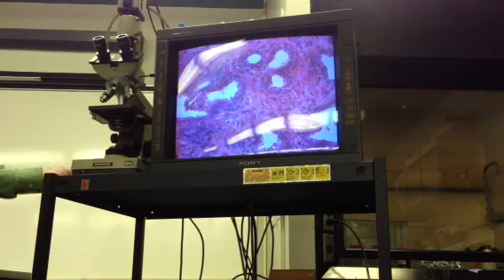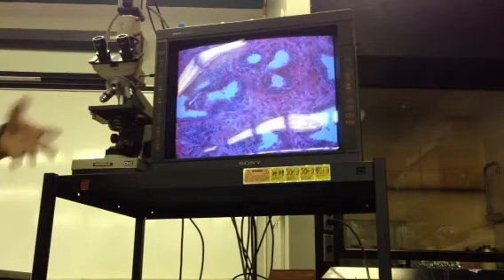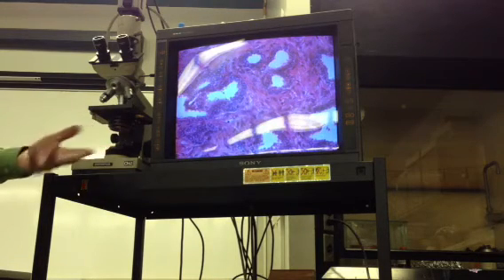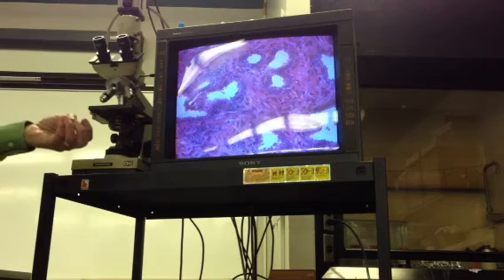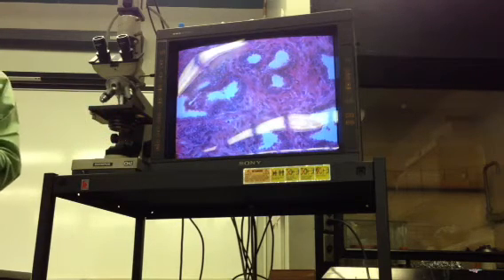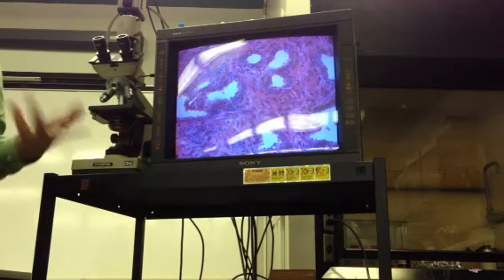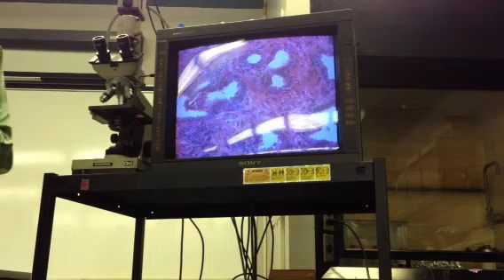Well, the first kind of question I would ask for any of these things would be to name the organ or the gland. So to recognize, first of all, that it's prostate. The second thing would be to recognize what hormone it may secrete or what hormone it's a target. Now, this is not an endocrine gland. It's a target tissue. So what's it mainly a target for?